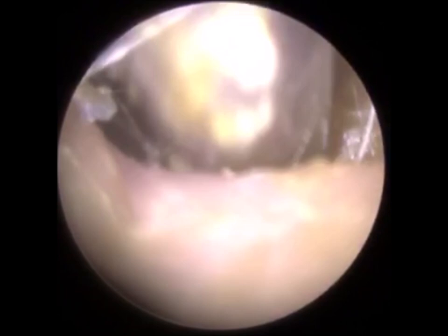I remember this particular point because this is where he was experiencing his otalgia. And as I was lifting this keratin off the canal wall, he was feeling that release of pressure and compression. It was getting bearable for him, and he was really willing me on here. This is the part that was causing him extreme discomfort when he attended. But it's so difficult. He's got a big crater below there, and the skin plug, it's just literally a dip. So I thought it's a good idea at this time.